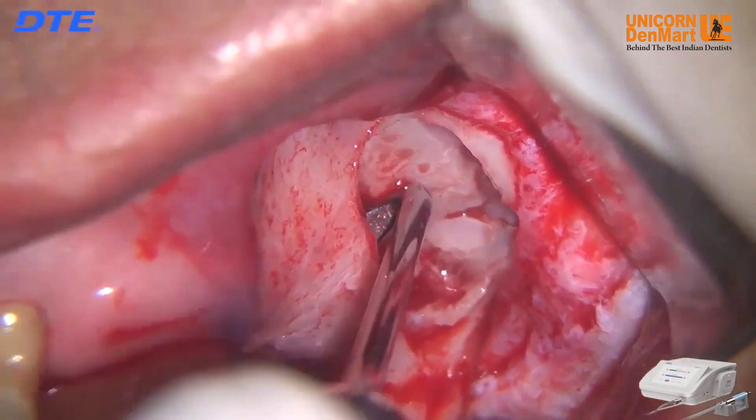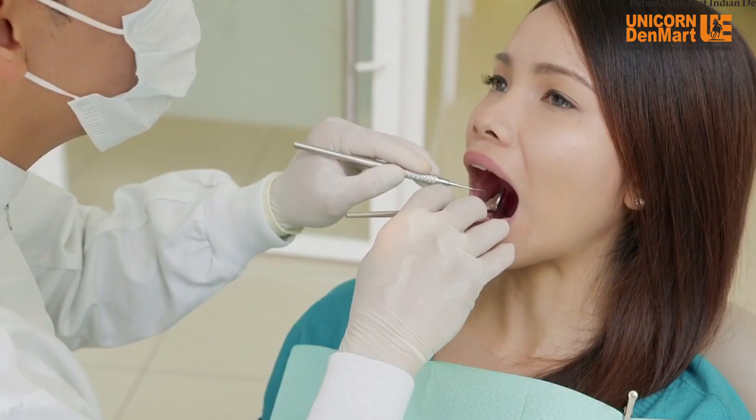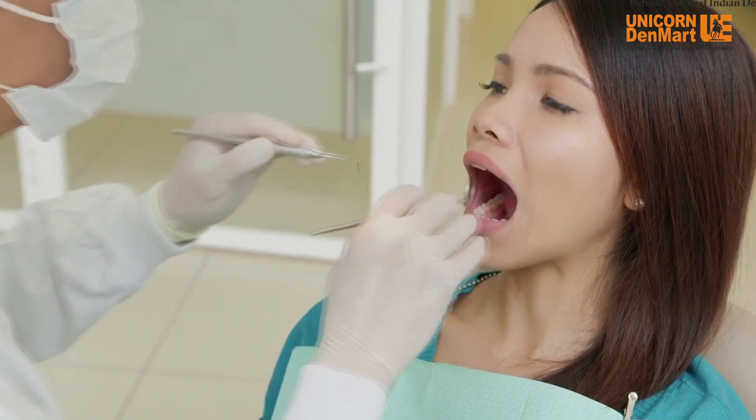Surgery X is a highly advanced third generation piezo surgery unit, providing a huge advantage not just to the doctors but to the patients as well.